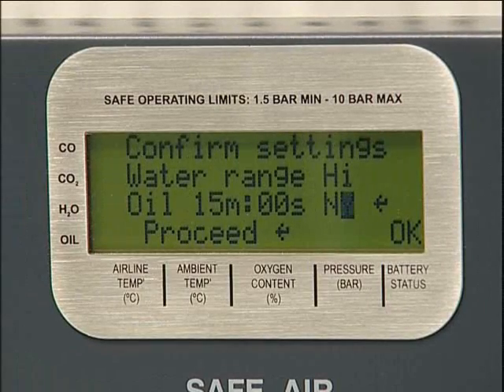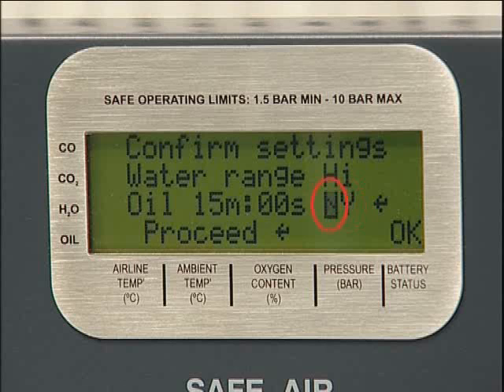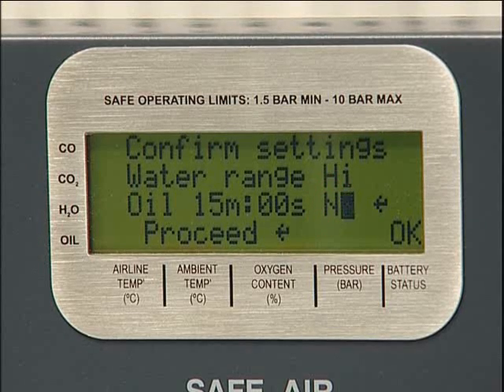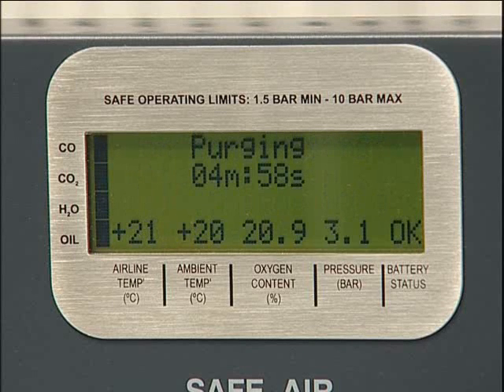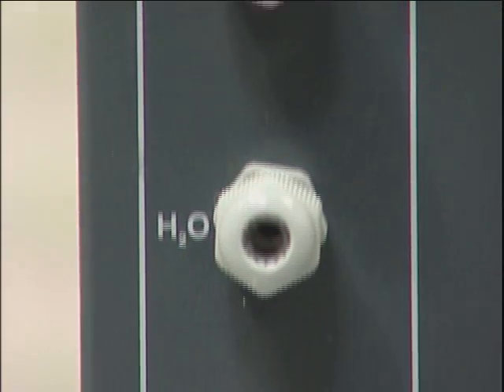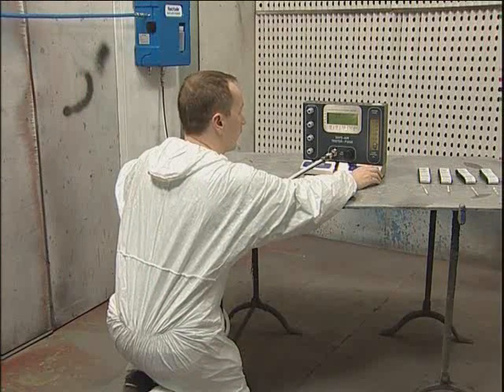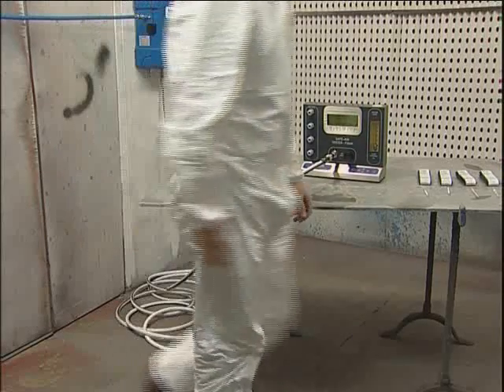Confirm that all settings are correct by selecting Y and pressing enter. If settings are not correct, select N and repeat the previous procedures correcting any errors using the scroll buttons. Confirm the amended settings by selecting Y followed by enter to move to the next screen. The unit will now commence a five minute purge sequence during which time airflow will be passed through all four tube ports. This clears contaminants from previous tests and ensures that a representative sample is being tested.